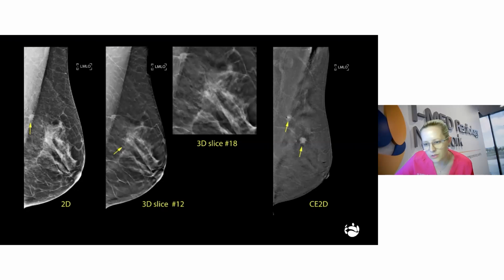And it's another study. You can see just behind the larger of those two lesions, a little area that's probably a satellite of enhancement as well. So contrast mammography serves two excellent purposes, and that is in the detection of breast cancer in dense breasts where the lesions can be obscured, but also in extent of disease to really ascertain whether there's satellite lesions or multifocal malignancy.